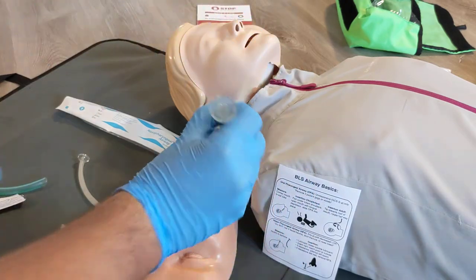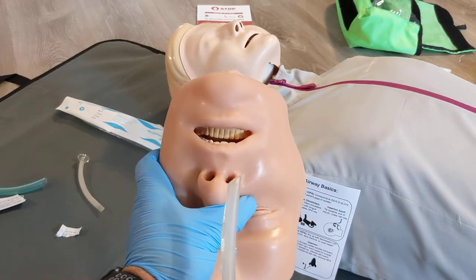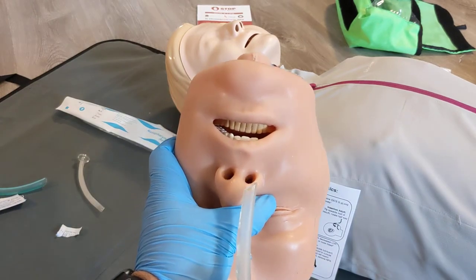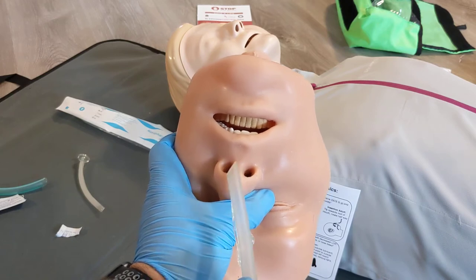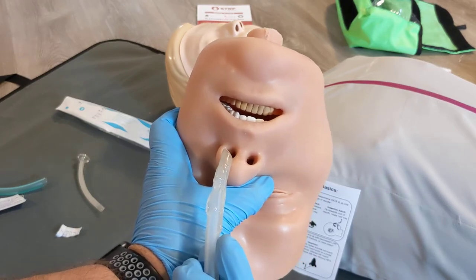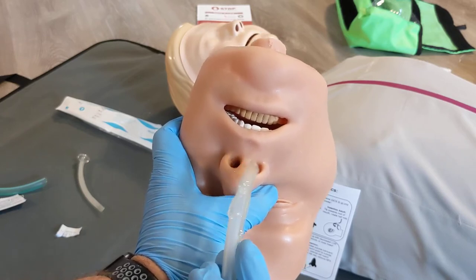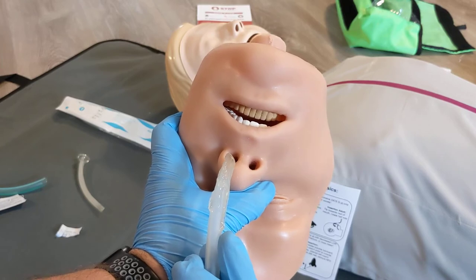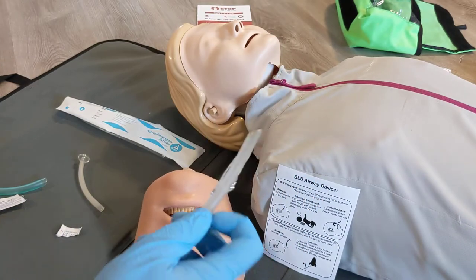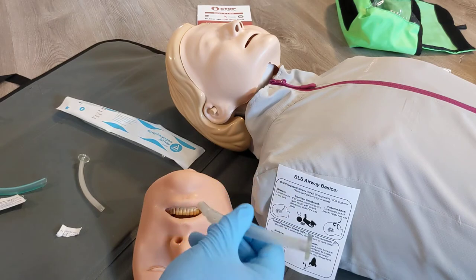You're going to make sure the point is always away from the middle of the nose. So if we're inserting on the right side, we're going to insert it this way. If inserting on the opposite side, we would turn our nasal airway to the other direction so the point is always away from the middle — that's where all the blood vessels are, so we're trying to avoid irritating that. We're always going to start with the right nostril first; if we meet resistance, then we'll try the left.